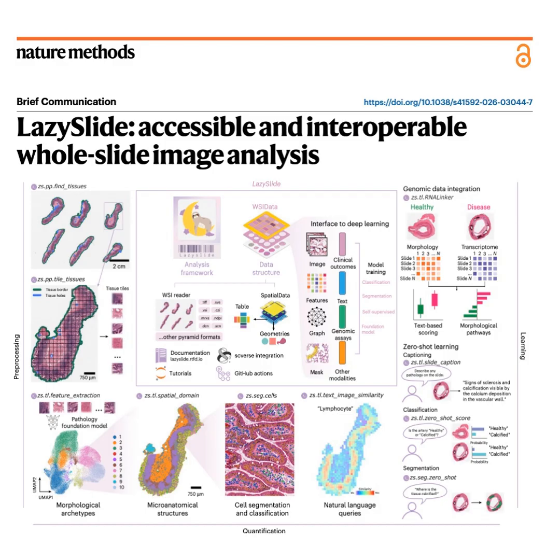Right. It also uses that GrandQC model to run quality control on a tile-by-tile basis. It throws out tiles where the tissue folded over on itself during preparation or where the scanner just went out of focus. You are left with a pristine grid of high-quality tissue architecture. And here's where it gets really interesting, because now we take these perfect little tissue tiles and we feed them into vision foundation models. Yes, the heavy lifters.